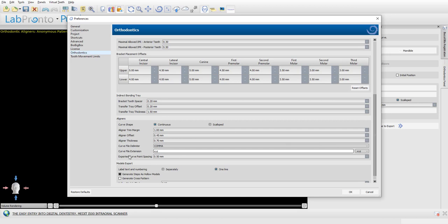The exported curve point spacing defines the distance between points — by default, a point every half a millimeter. These last three settings — delimiter, file extension, and point spacing — all relate to the generation of the coordinate file the software exports and transfers to the milling machine.